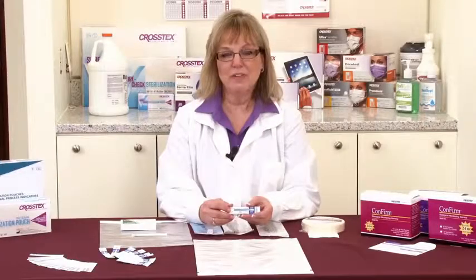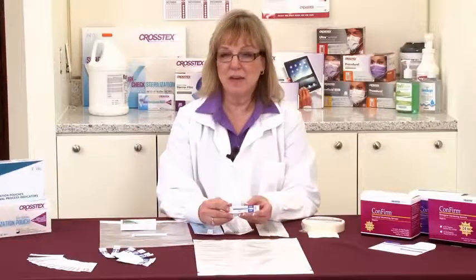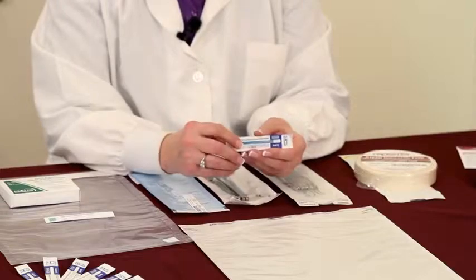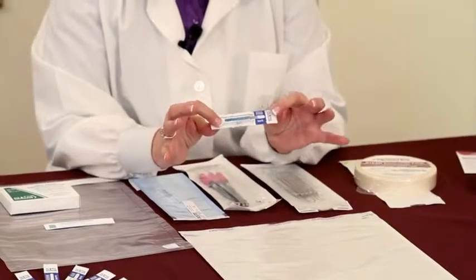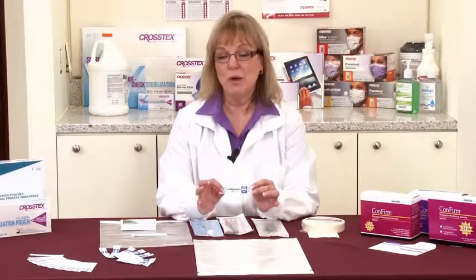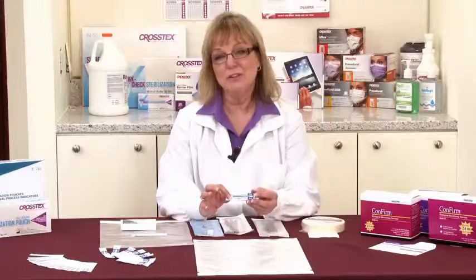A significant benefit of the Class 5 integrator is its ability to provide distinct pass or fail results. The average cost of an integrator strip is less than $1 a piece, yet it can provide enhanced confidence about the success of the sterilization process. It's also important to note that the Class 5 integrator can only be used within a steam sterilization cycle, whether it's a gravity displacement, dynamic air removal, or an immediate use sterilization cycle.